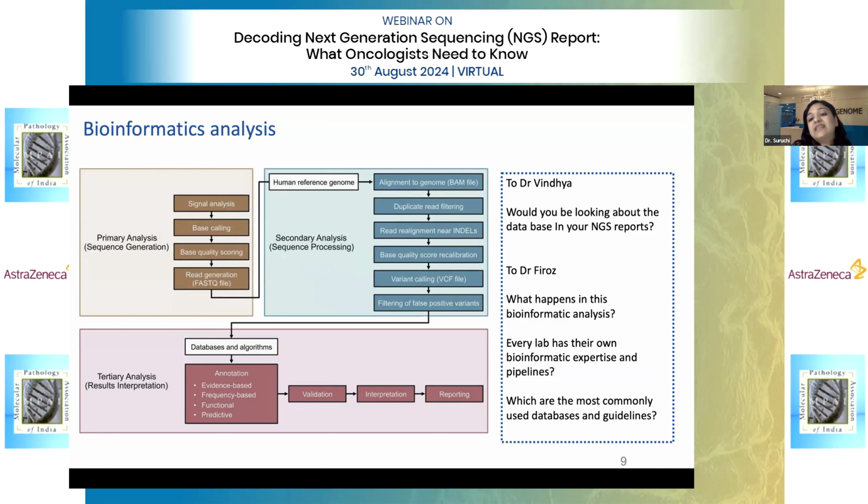Then it makes sense that the whole three things are completed: tumor indication, gene, and the specific variant. And the specific variant is very, very important. The more you look at NGS reports and the more you discuss with the molecular pathologist or the scientist, the more you see that. We should not jump the moment a gene comes positive.